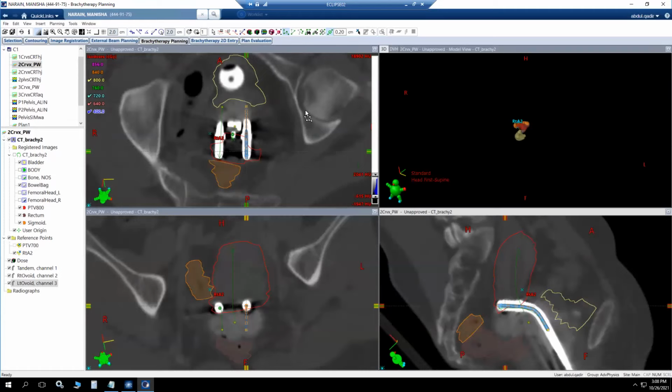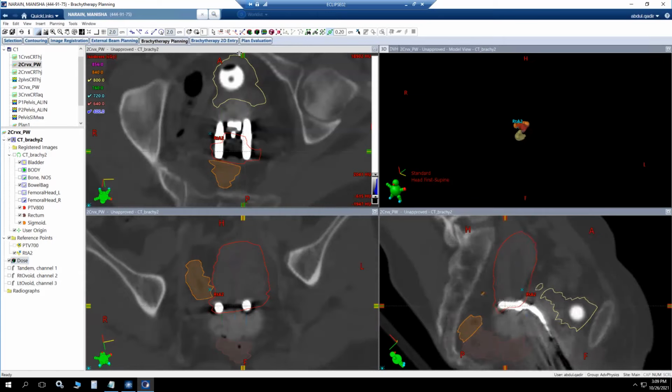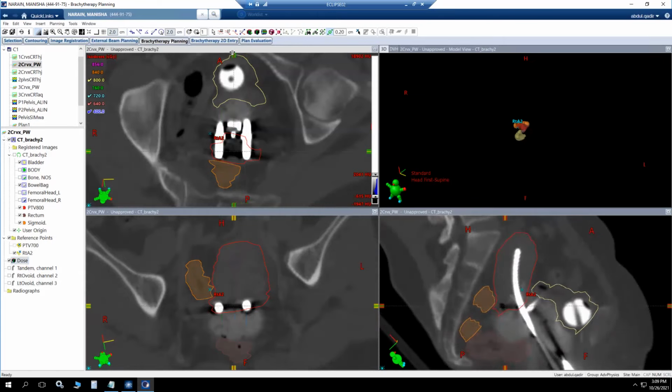Now people have talked about this, that we should mark the point A as well, although we are doing the CT-based planning, but for reference. If you cannot achieve the dosimetric isodoses you want to see, then at least you should cover the ICRU point A dose. That is classical, and there is nothing wrong with doing this while following the ICRU protocol. So people have thought that even while doing your CT-based planning, you should mark your point A, so that you at least deliver the dose to point A.